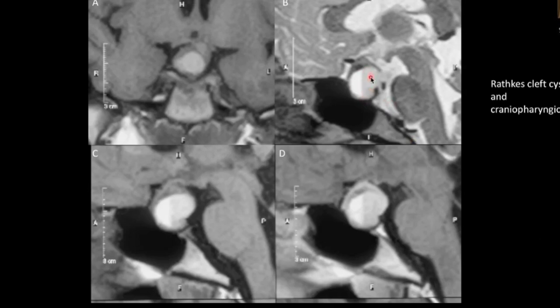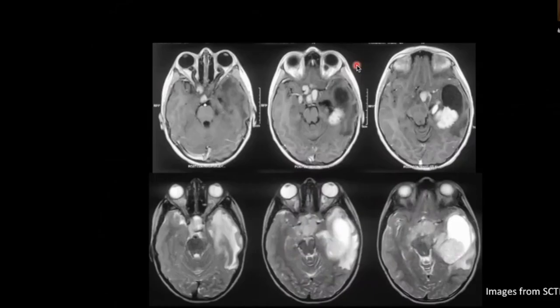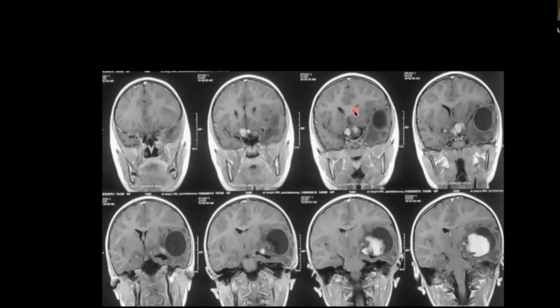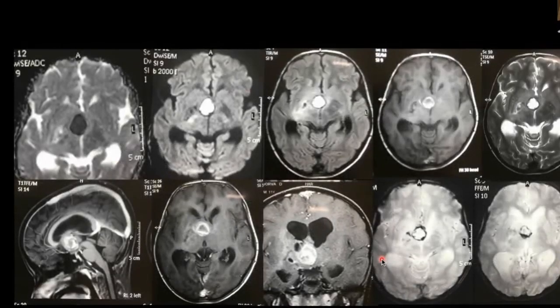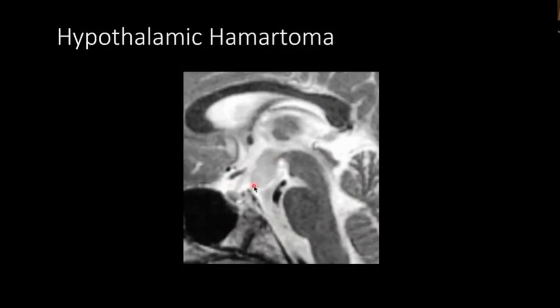Sometimes craniopharyngiomas are associated with other pathologies — we had a patient with a Rathke's cleft cyst and an associated craniopharyngioma, with a fluid level well seen on sagittal images. Returning to a previous case: a child with the adenohypophysis seen separately from a suprasellar heterogeneous solid-cystic lesion — this was an optico-chiasmatic glioma. Another patient with an optico-chiasmatic glioma showed an enhancing optic chiasm with a parasellar solid-cystic mass. A further patient with a suprasellar lesion showing extensive blooming on gradient and T1 hyperintensity was a pilomyxoid astrocytoma with BRAF mutation positive, with hemorrhage within.